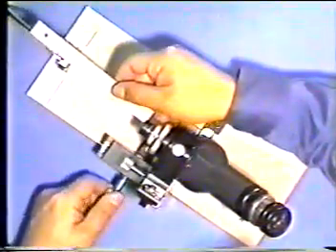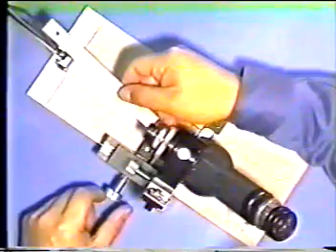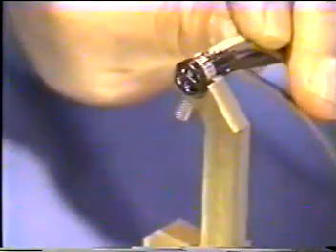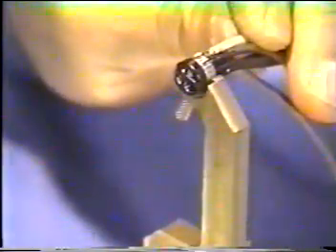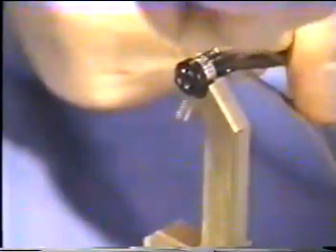Illuminate the IG through J60064. The microscope should be finely adjusted to each model. Looking through the microscope, focusing and image tilt should be adjusted. Completing adjustment, fasten the set screw and fix the IG. Apply K445B around IG and DEL.